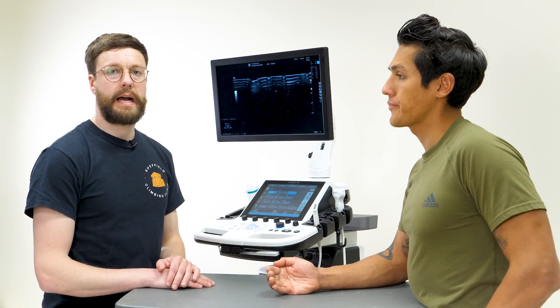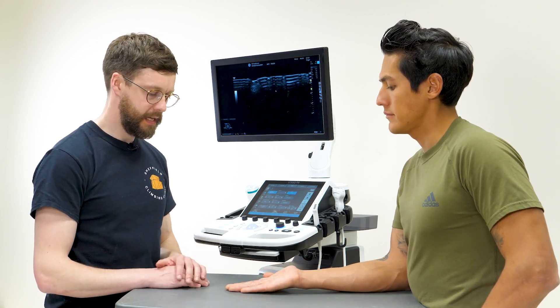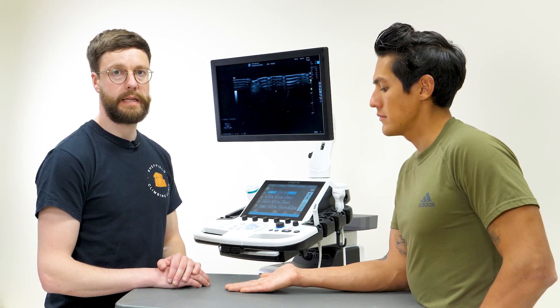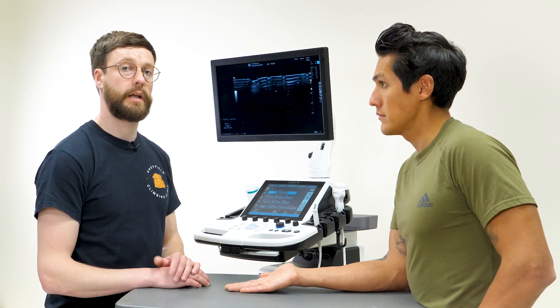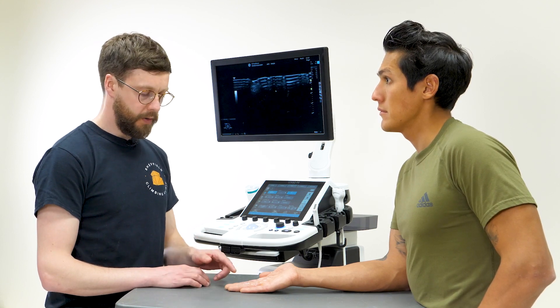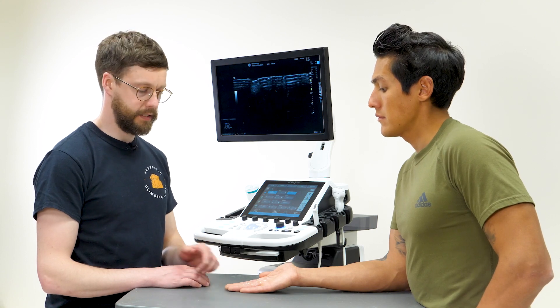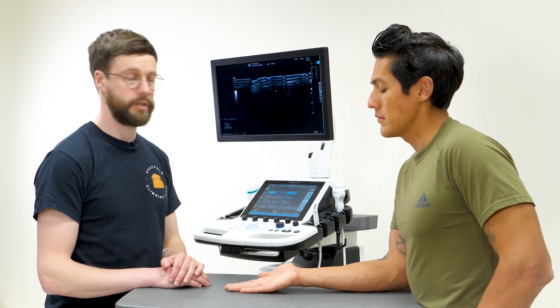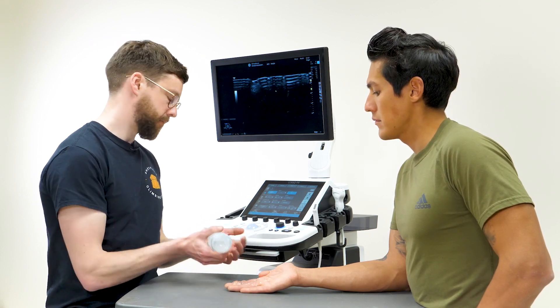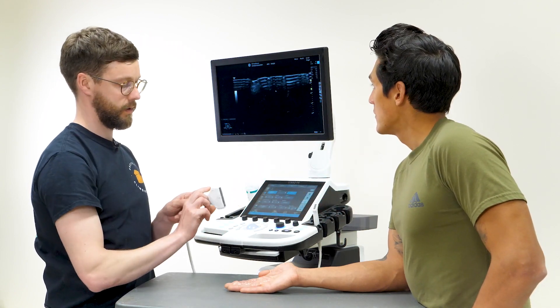Let's scan the A4 pulley. The A4 pulley is very similar to the A2 pulley — it is observed on the ultrasound scanner as a smaller version of the A2 pulley. Its location is between the proximal interphalangeal joint and the distal interphalangeal joint. We'll put some more gel over the area of the A4 and begin scanning.